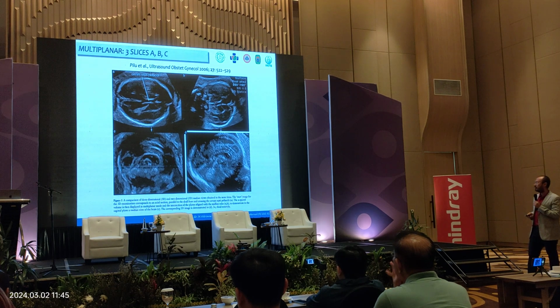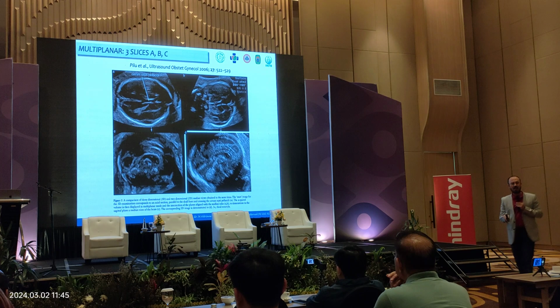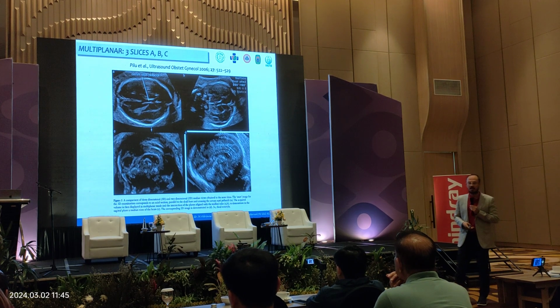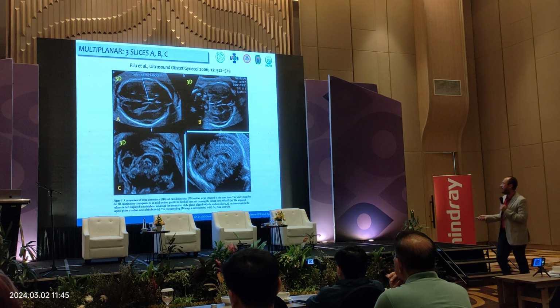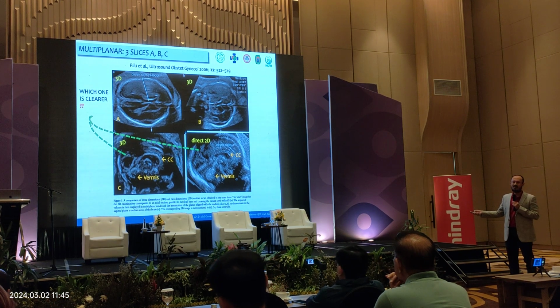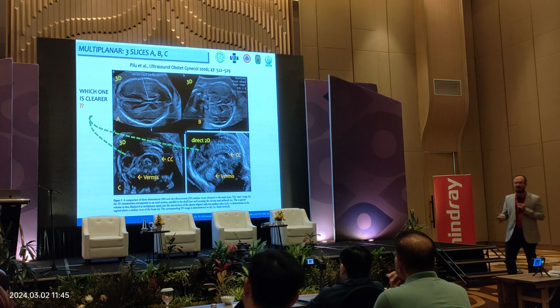So this is a study from Pilu's publications that we can see to compare how clear we can see between transabdominal three-dimensional neurosonography and 2D direct transvaginal. How can you appreciate this? Between a direct two-dimensional, 2D direct, we can appreciate it. It's clearer.